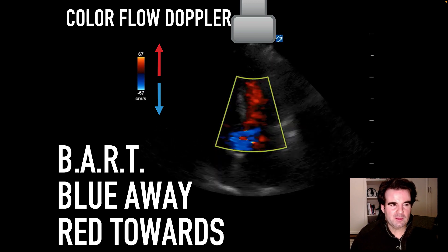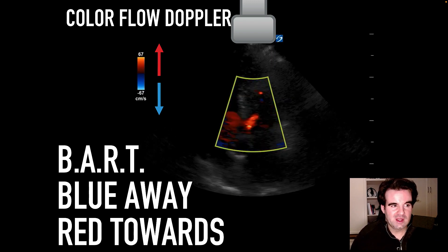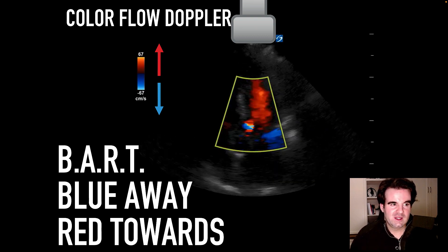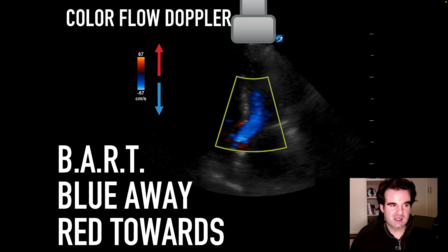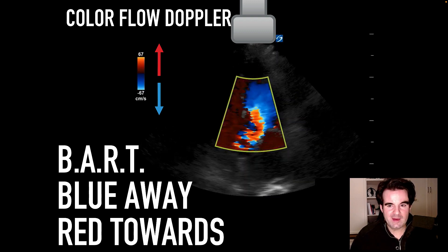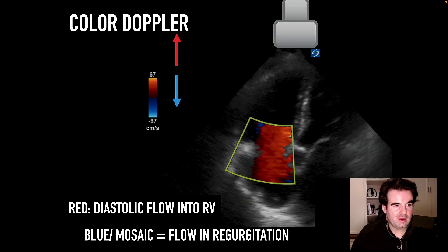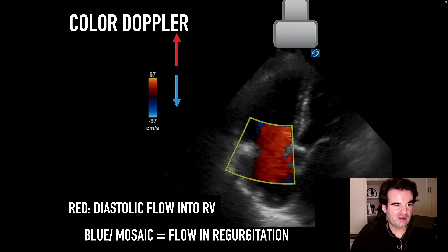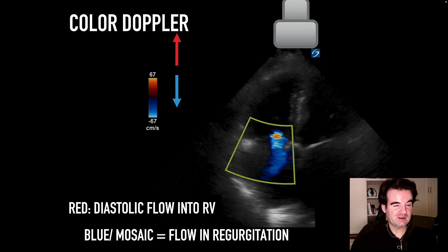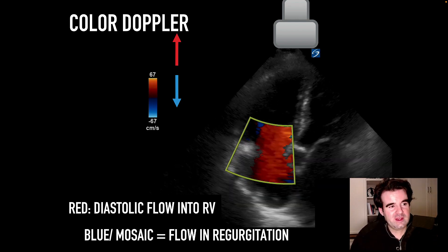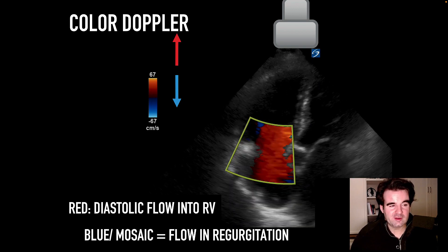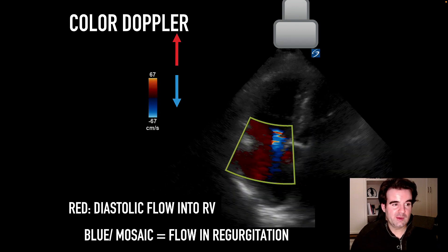We use Color Doppler in cardiac ultrasound to recognize regurgitation and stenosis, and it is also often used in vascular ultrasound to look at vascular flow imaging and evidence of abnormalities. In this apical four-chamber view, we can see diastolic flow from the RA into the RV representing that red shift — flow towards the probe. We can also see evidence of regurgitation with flow in reverse of the probe, registering as a blue shift with some other colors mixed in, which we will get to.